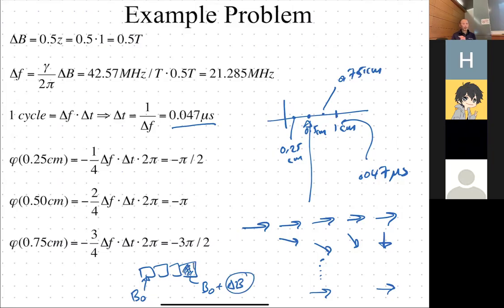Typically a gradient might be, say, 4 Gauss per centimeter, so over a millimeter there's very little change in that field. Remember, a Gauss is on the order of Earth's magnetic field. We're talking about very small changes compared to the main field, which is, as you saw, 60,000 times stronger at 3 Tesla. So even if you average over a small volume, it's basically the same number.